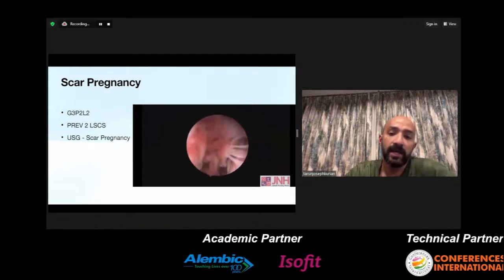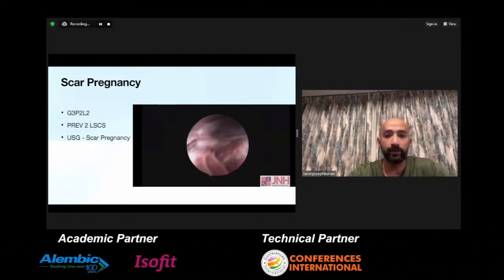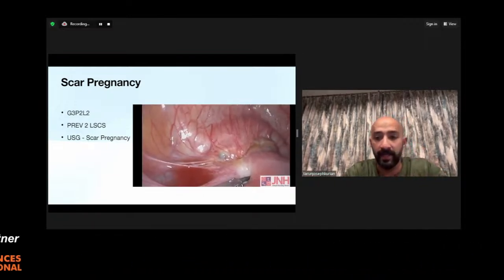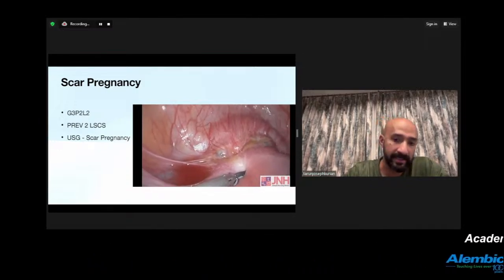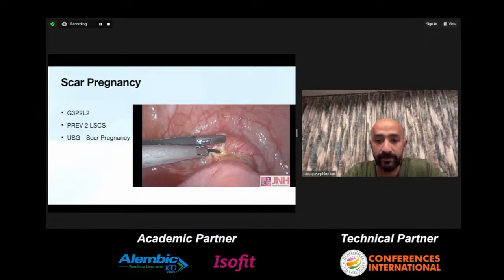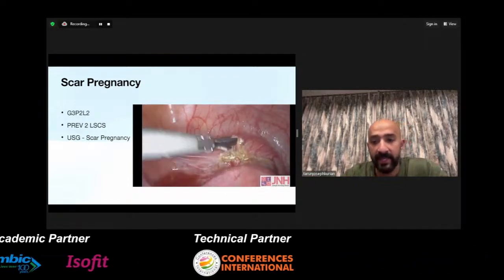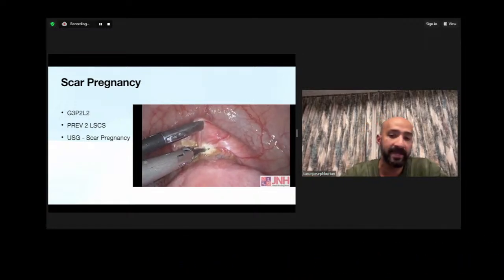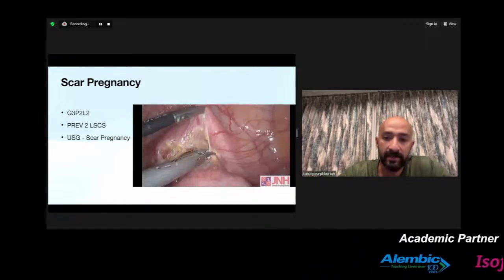If the patient is not desirous of fertility, this can be tackled hysteroscopically also, which was something that we considered in this patient. We considered tackling hysteroscopically. But because of bleeding, we decided to go laparoscopically to deal with the entire thing. So if a patient does not require fertility, you can deal with it hysteroscopically as well. So the first step is to dissect off the bladder. Again, being a scar pregnancy, if you would like, you could think of vasopressin, you could think of ligating the uterine artery at origin, but it's not something that we routinely do at our center.